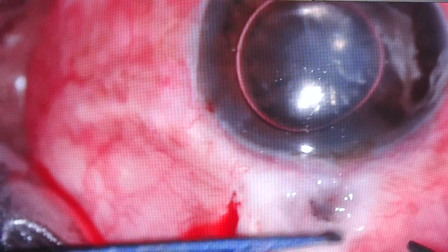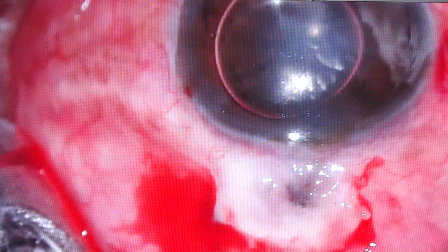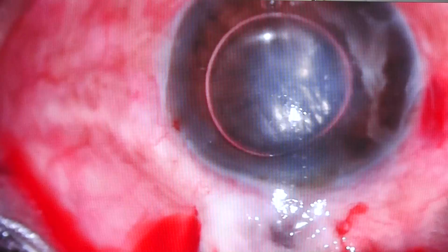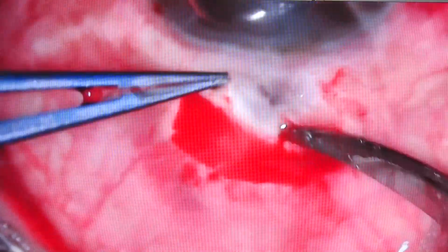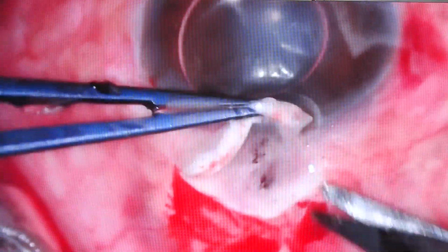Normally, if we have a leaking bleb, we might just remove the conjunctiva and put an amniotic graft as an inlay. But here, the rest of the tissue was quite tough, so I just thought of lifting it up and placing amniotic membrane as an inlay inside.